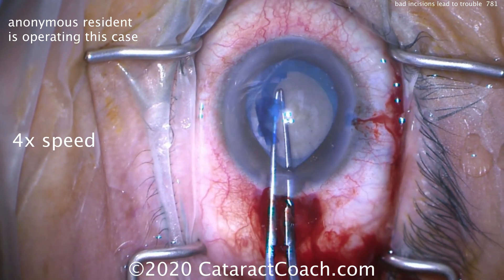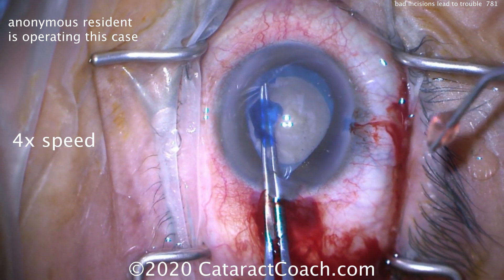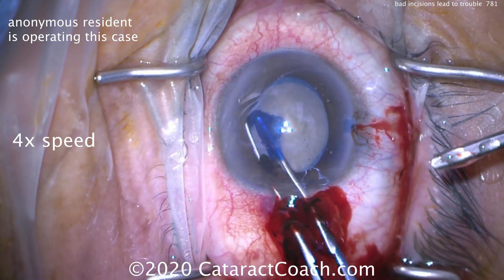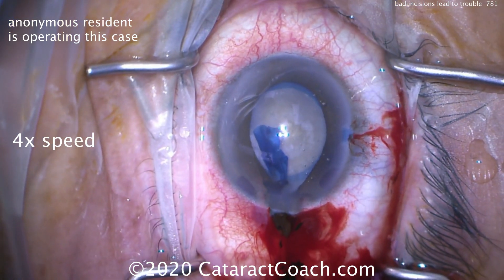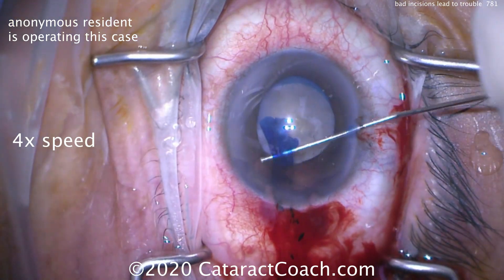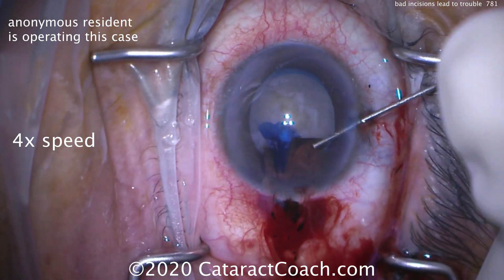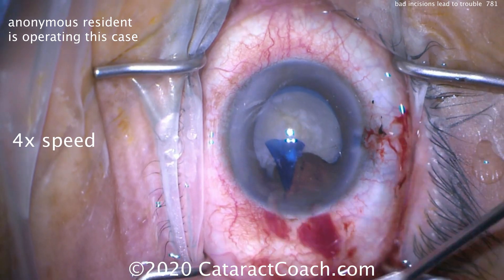Capsulorhexis is being created — that goes very well. But look at the prolapse of the incision. Now this is also a tough case: the patient's hyperopic and has Flomax issues, so floppy iris syndrome. That incision is going to be difficult. It'll be a huge problem to operate through that incision for the whole case. Look at that iris prolapse.